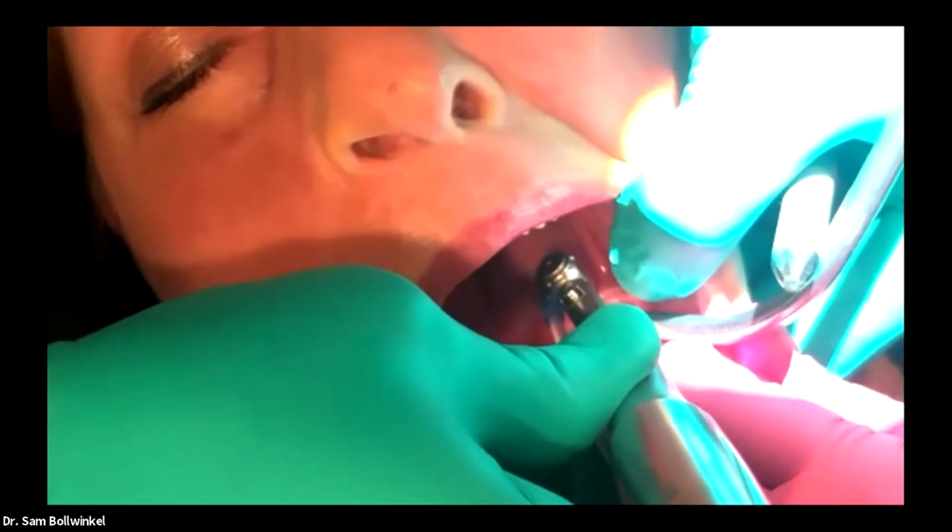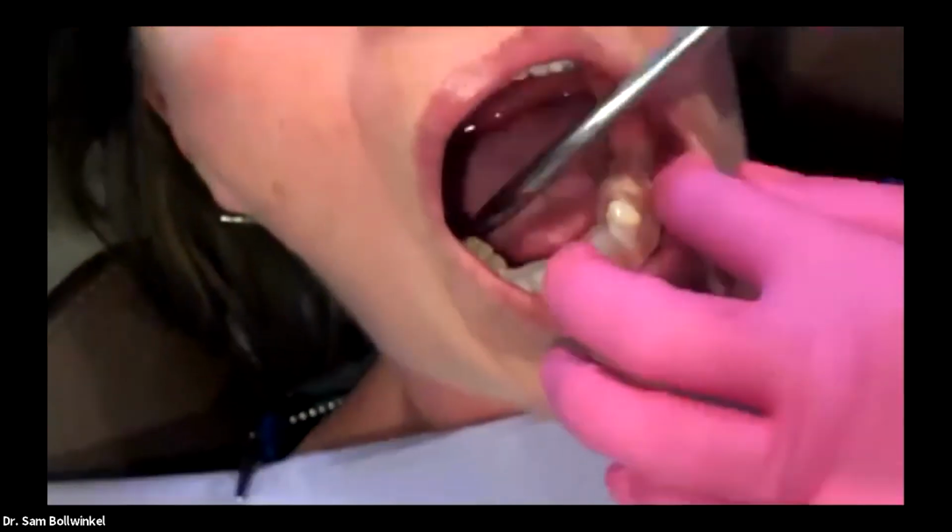Come in with drill number 3 here. Okay. Let's go ahead and take that guide out. Do a little irrigation for her. Let's take a look at that side.